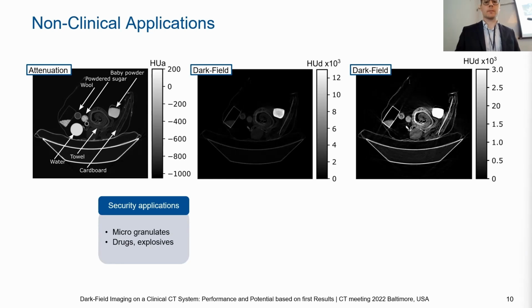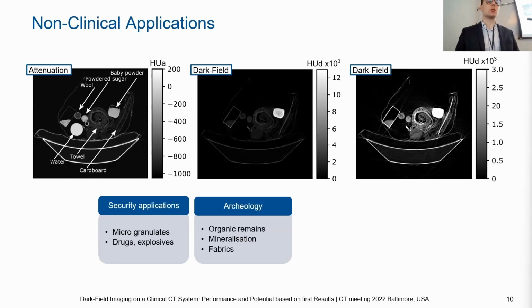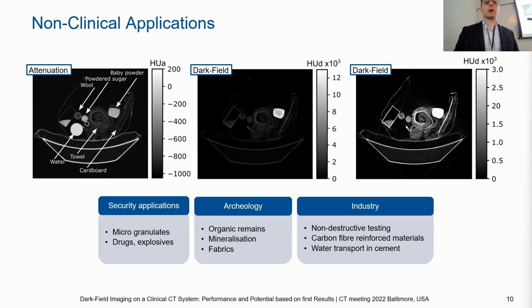Another possible application is in archaeology, where we can use dark field imaging for organic remains or the analysis of fabrics. And lastly, there are also industrial applications in non-destructive testing, or for example, there have also been studies performed on the transport of water in cement.